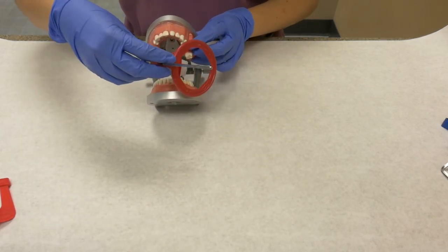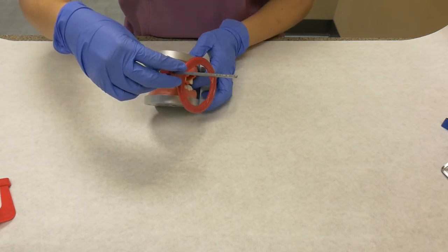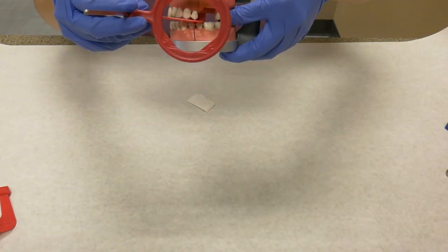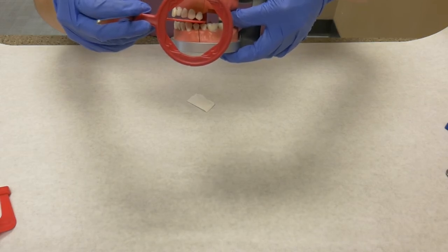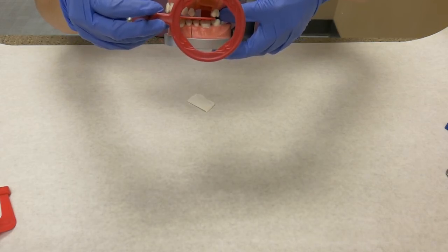This setup is used for a premolar bite wing, which is placed around the second premolar, and a molar bite wing that is placed around the second molar.